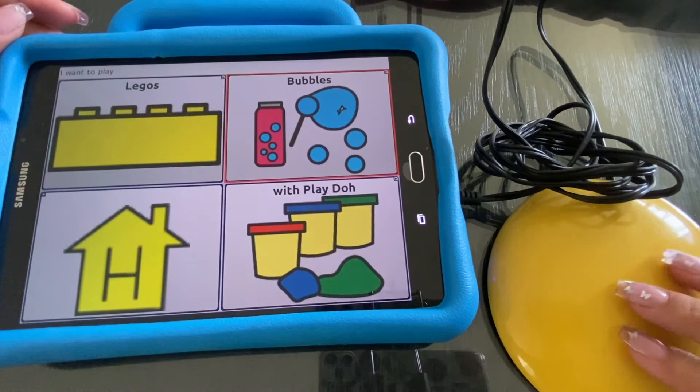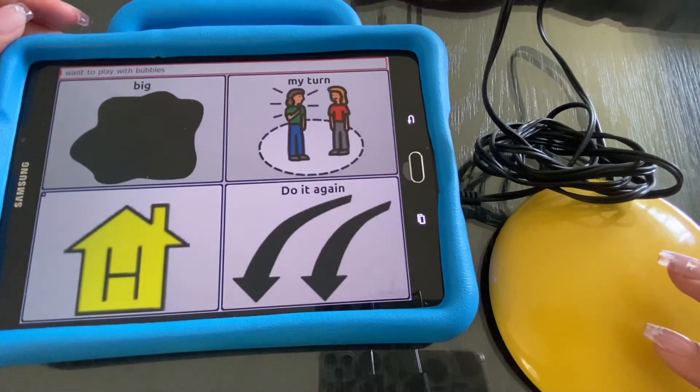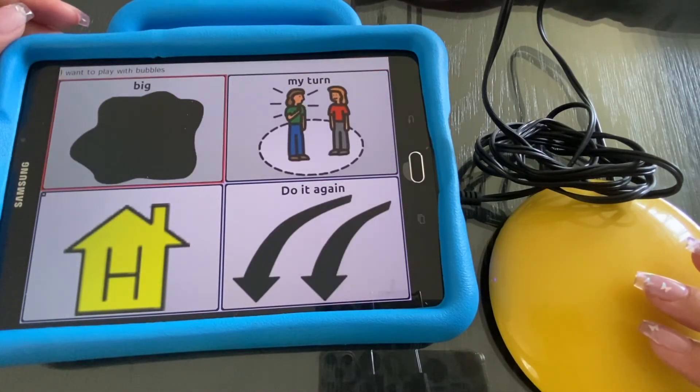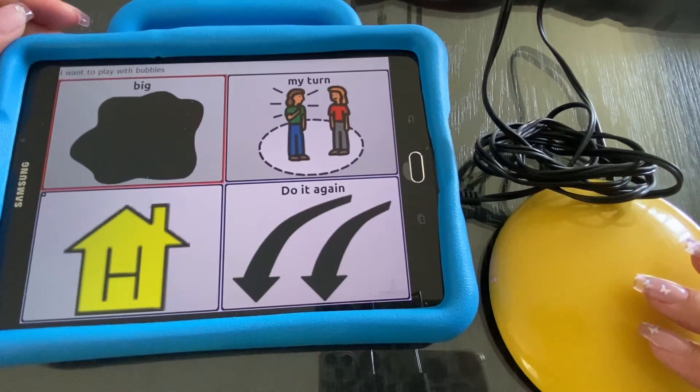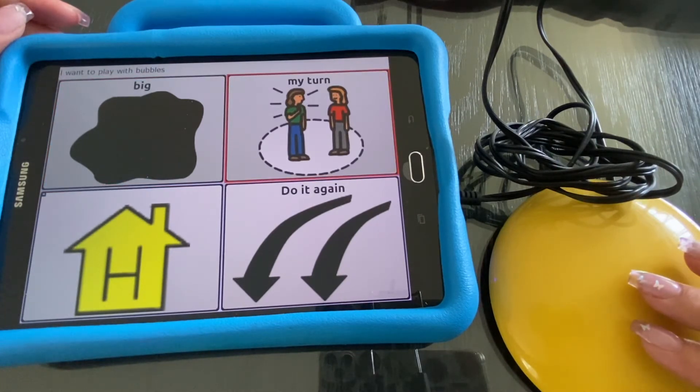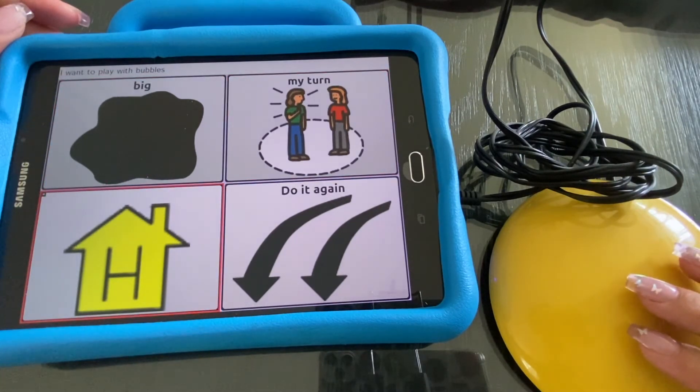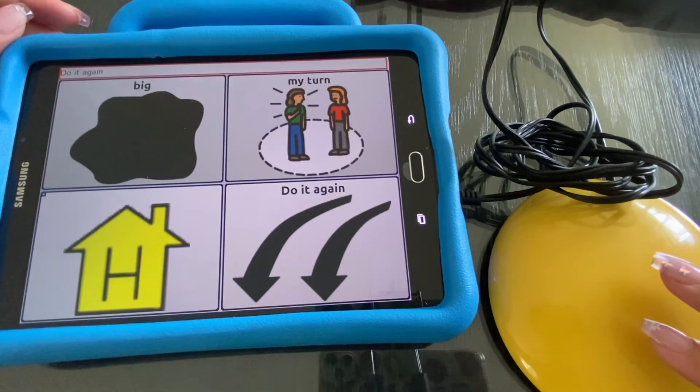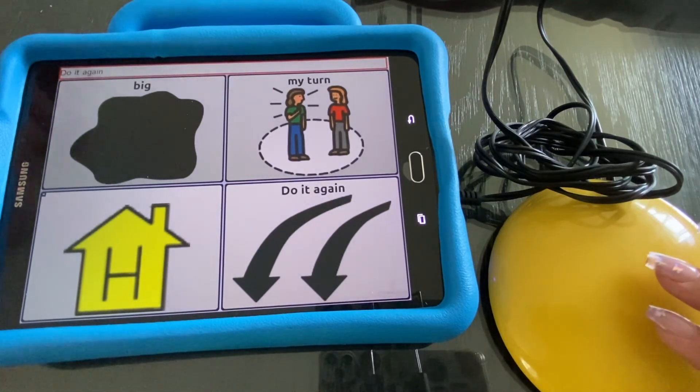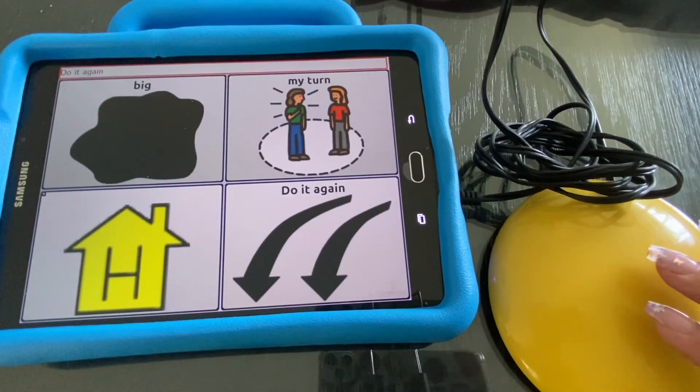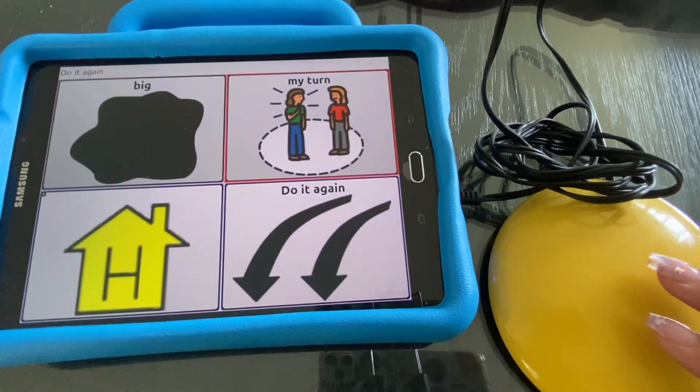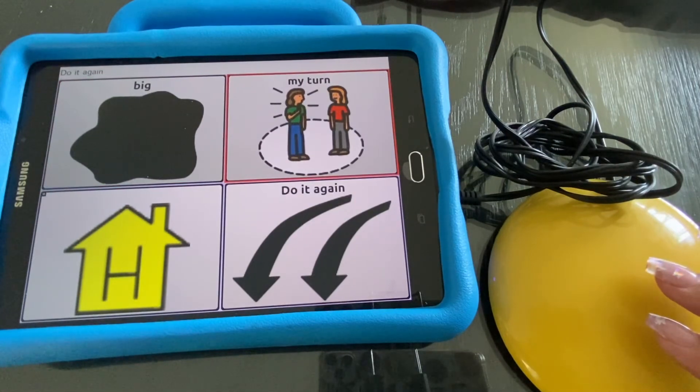With bubbles. Speak text. Back. My turn. Do it. Do it again. Speak text. And you can always control the speed that it scans. Speak text. I want category places.